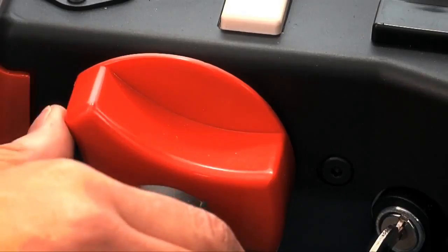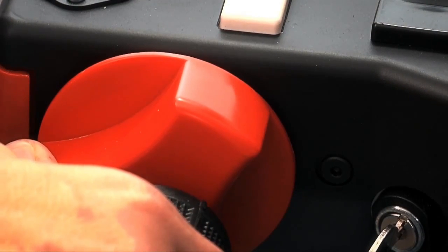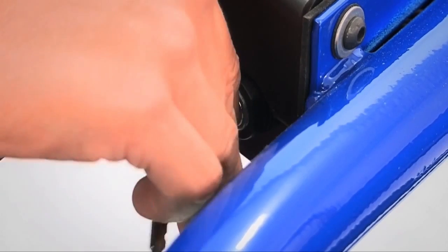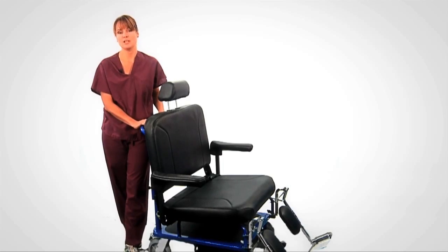Turn the power on and try to move the unit forward or backward. If properly connected, the Breeze should not move. This feature ensures not only safety, but that the connections have been made correctly — the outlet has power and the unit is charging. Turn off the power to the unit while charging. If the Breeze does move, check the power cord connections. If that does not correct the problem, try a different outlet or have the maintenance department check the outlet you are using. If this still does not correct the problem, the battery charger system and batteries need to be serviced.